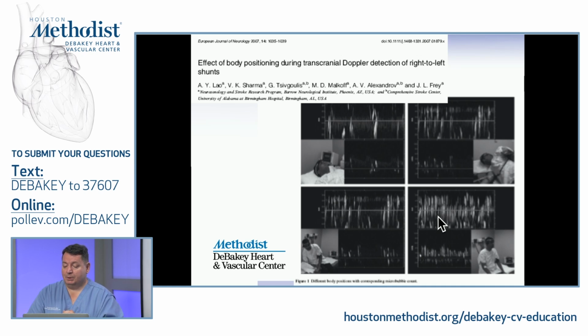So our protocol is the sitting position, and in the sitting position you can do the best Valsalva. I think this is what we practice when we're going to the bathroom, and that's the other way of telling the patient, if the Valsalva meter is not really showing, how the velocity needs to go down. If the velocity is not changing, the patient is blowing the air out. So again, this is my maneuver to really understand how to do the Valsalva during my TCD bubble test.